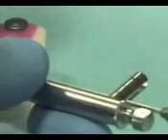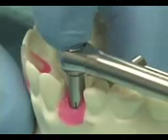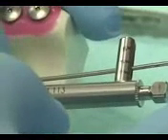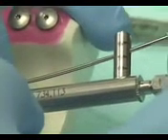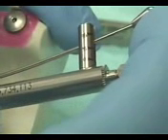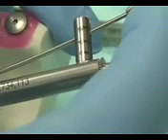The torque driver fits over the top of our abutment driver, and now when we torque this to 35 Newton centimeters, we touch only the flexible wire portion, and we torque that until we see that deflection go to 35 Newton centimeters. And once that's deflected to 35 Newton centimeters, we have now torqued our abutment to manufacturer's specifications.